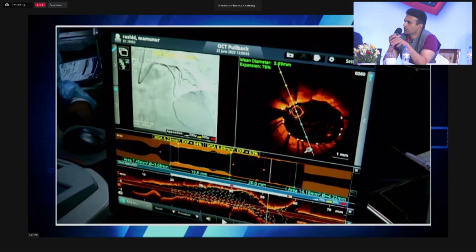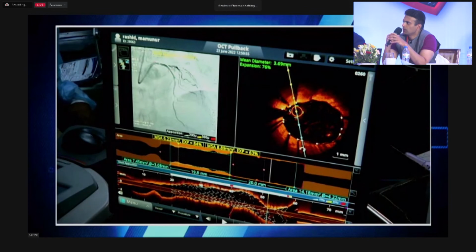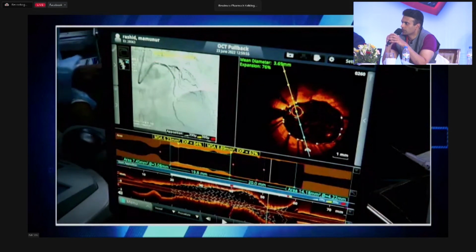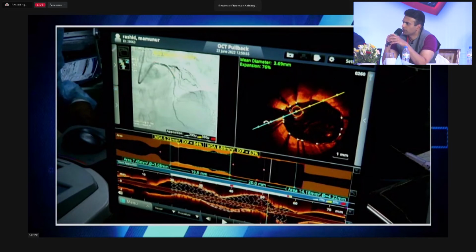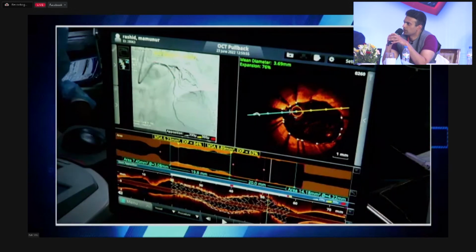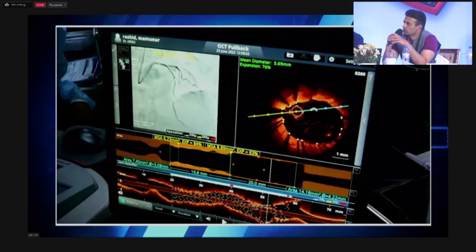So that's the question that we're trying to figure out, right? We're trying to figure out if that's plaque prolapse, and then if so, determine how much of the lumen it takes up and how long it is, because that determines whether or not you need to post-dilate it again or put in another stent. Or if we can just leave it, or if that's swirl artifact. Yes. But this is not the spot. We need to go distally by about 2 millimeters. Yes, and this is not extended. Yes. And you probably won't see that on a longitudinal view. Well, if it extends more than 5 millimeters, then we do aggressive post-dilatation.